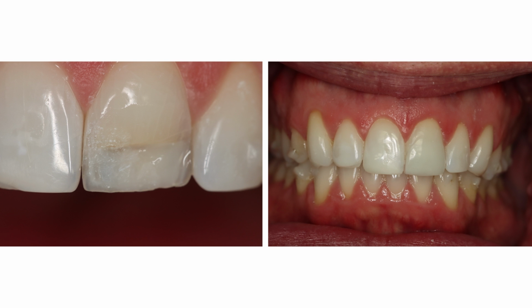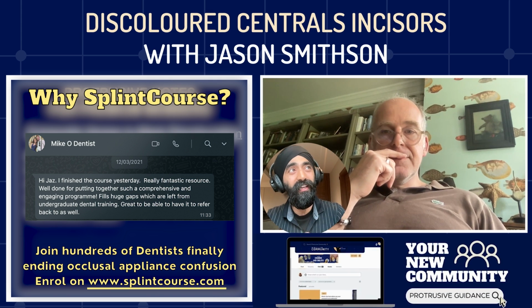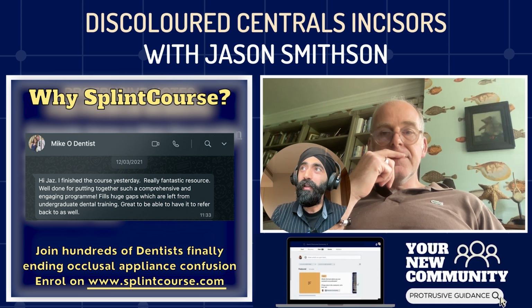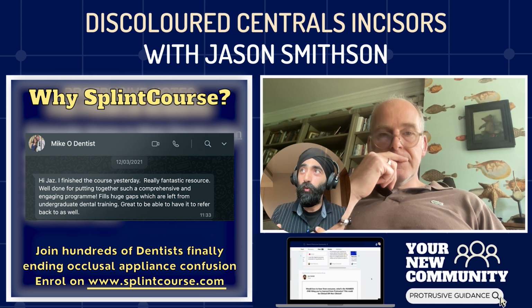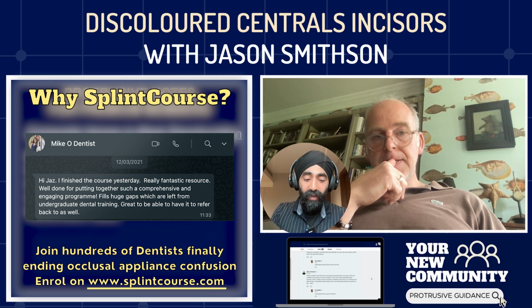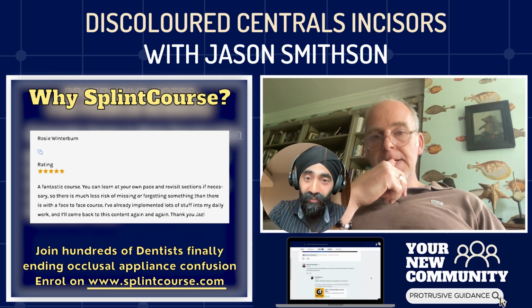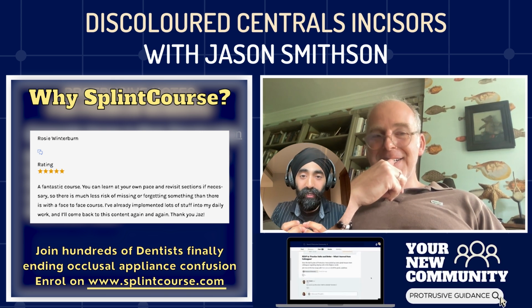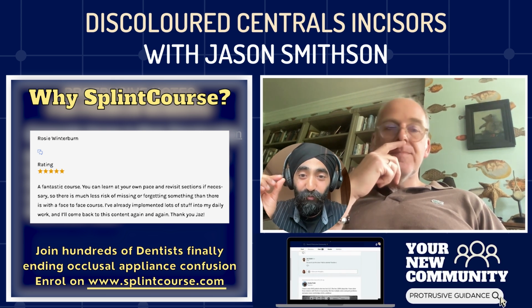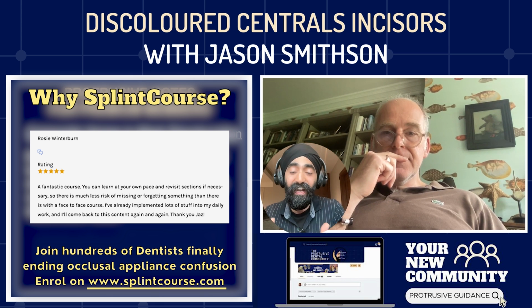But what I did is I got some composite. This was like Estelite Asteria. I think this was like NA1B. But his adjacent teeth he'd been whitening were just a higher value. So what I did is I got my composite, and then I got some white tint liquid, and I rubbed my composite into the white tint. So I let the composite absorb the white tint, if you like. It wasn't like pools of it, just a few drops. And that worked well to lift up the value. And then I used it, and then I covered it with some enamel.